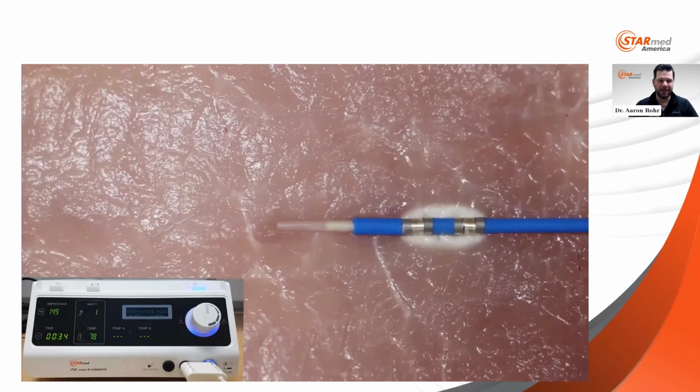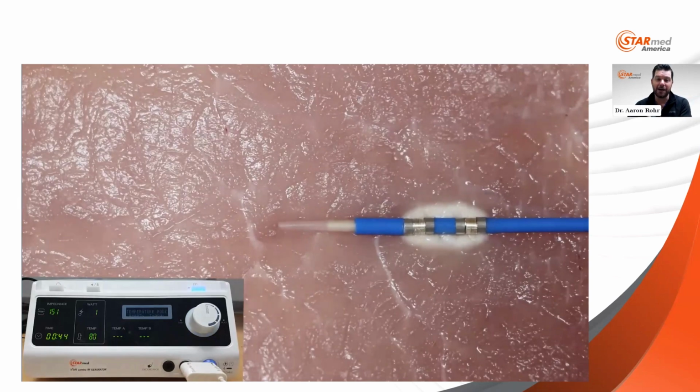And then we're also getting everything we need clinically along with this. So as you can see here, the wattage and temperature vary, the impedance tries to stay consistent, and our time continues. So that just allows us longevity with the process in order to get to that 2-minute marker.